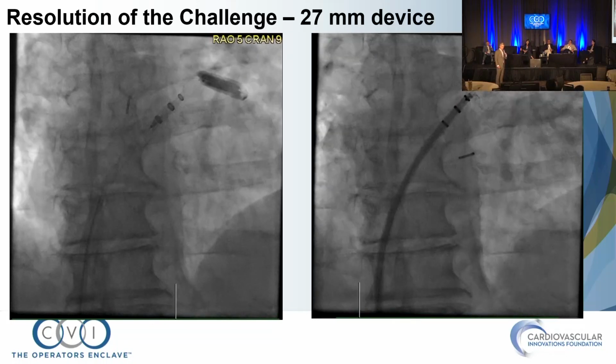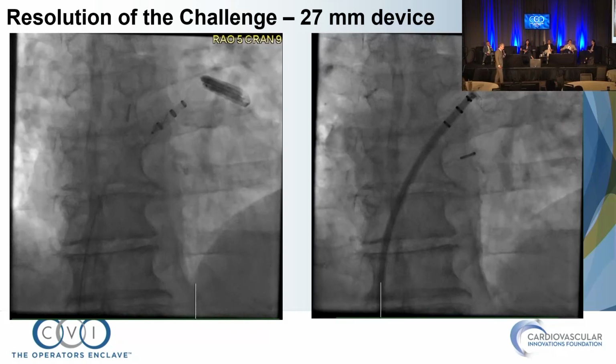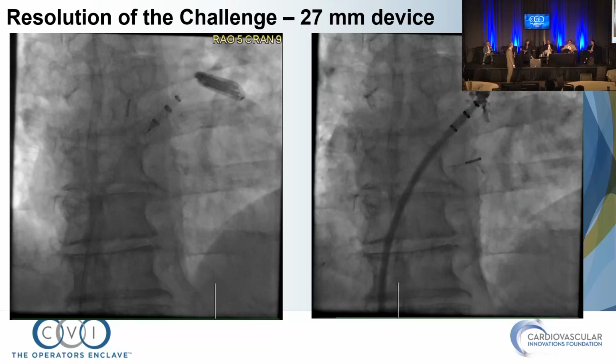Certainly not with a 12-millimeter pouch. I think that would be an unsuccessful left atrial appendage ligation by definition, greater than 10 millimeters. There are people with small appendages.